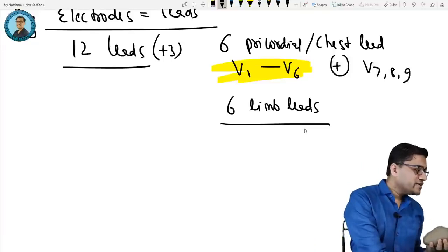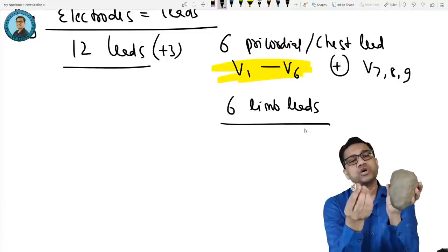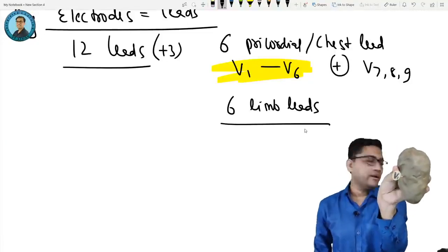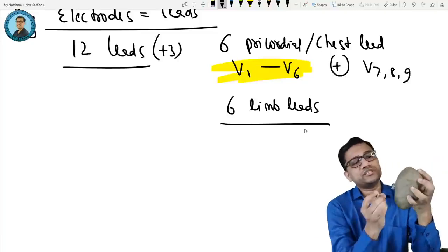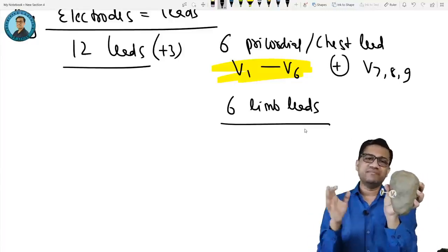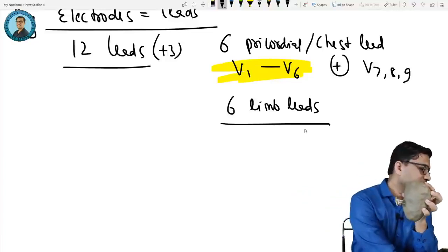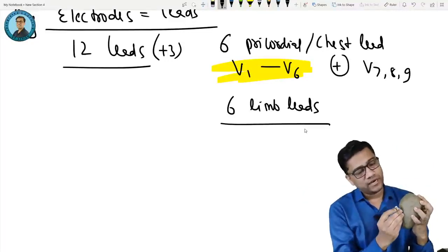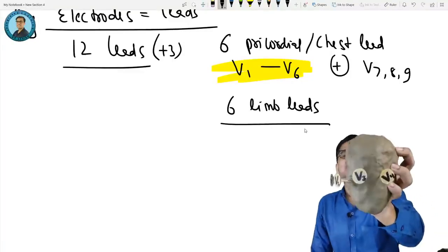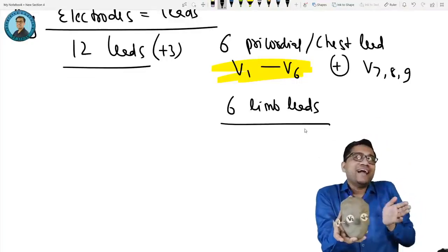So what we start with is the precordial leads. V1 is put on the right side like this. Can you see? So this is lead V1. Then we will put V2 at the next location. We don't have to learn the exact locations, like fourth intercostal space; I just skip that. These two are seeing the side, that is the septal. Whereas if I put V3 and V4, they are seeing the front, the anterior. And this side is the lateral or left side.